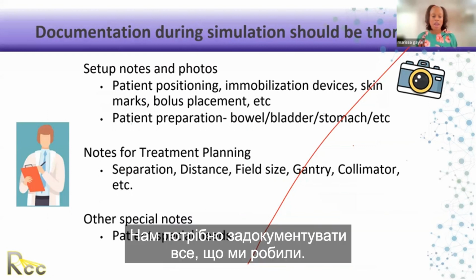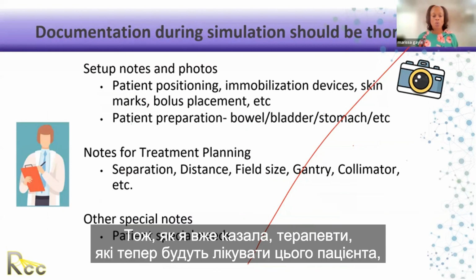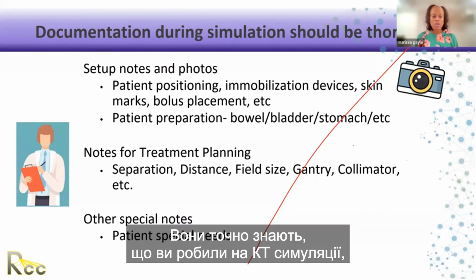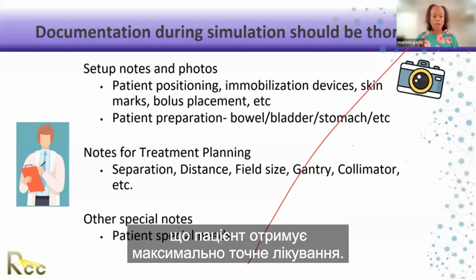We need to document everything that we did. And we need to create setup notes. So the therapists that will now be treating this patient have the game plan. They know exactly what you did in the CT sim so that they can reproduce it each and every day to ensure that the patient is getting the most accurate treatment possible.